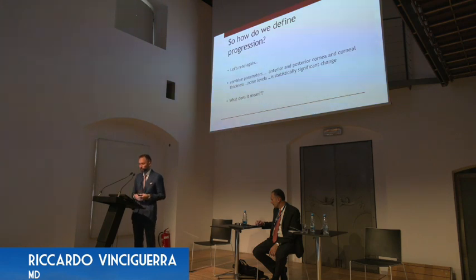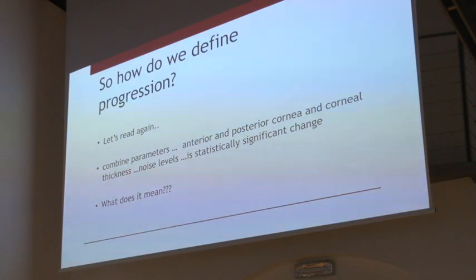So how do we define progression then? Let's read again. We have to combine parameters first. We have to use anterior, posterior, and thickness, and then the noise level. But what does noise level mean?